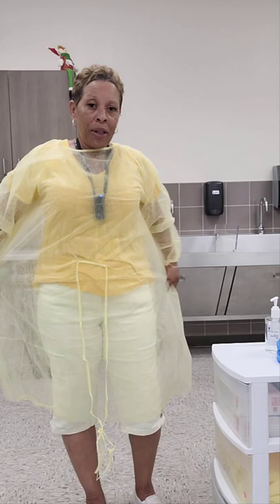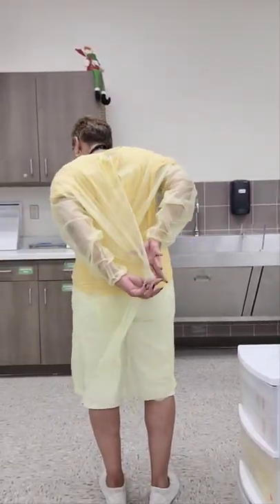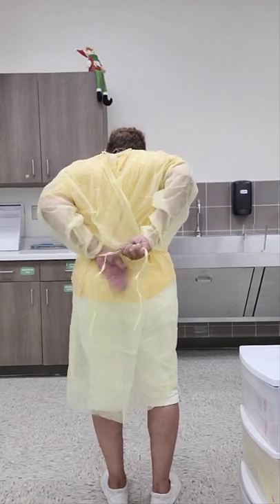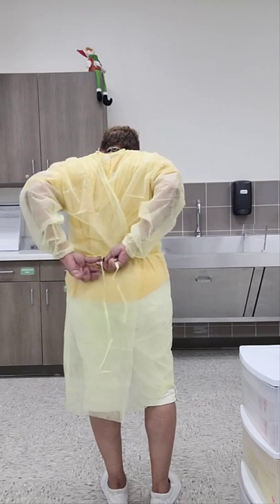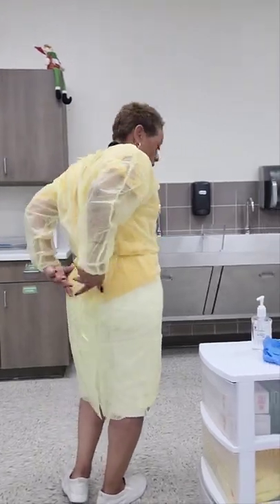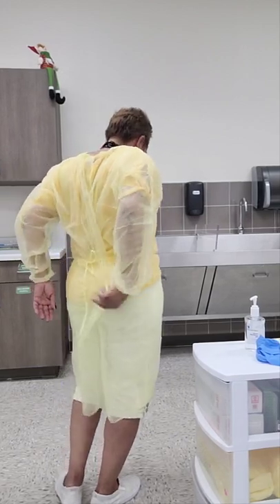Now that I have my neck strap tied, I'm going to close my gown as much as possible in the back, and then tie my waist strap — again in a loose bow or slipknot. Then I'm going to readjust my gown to make sure it is completely closed in the back. The next thing I'm going to do is put on my gloves.